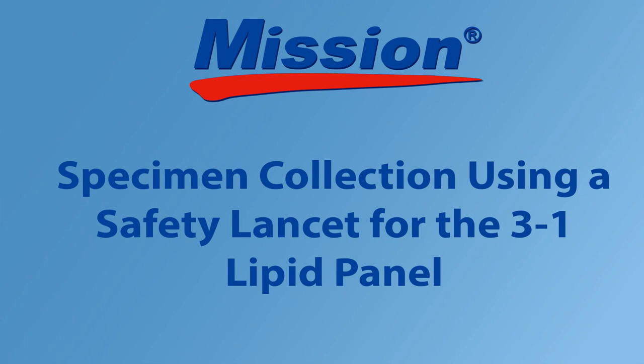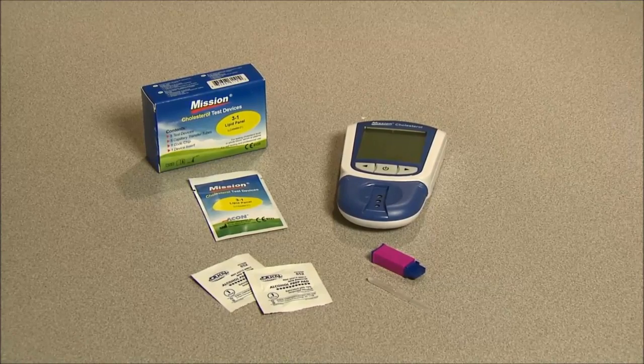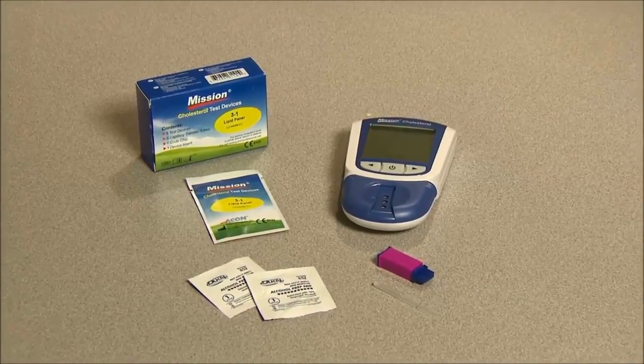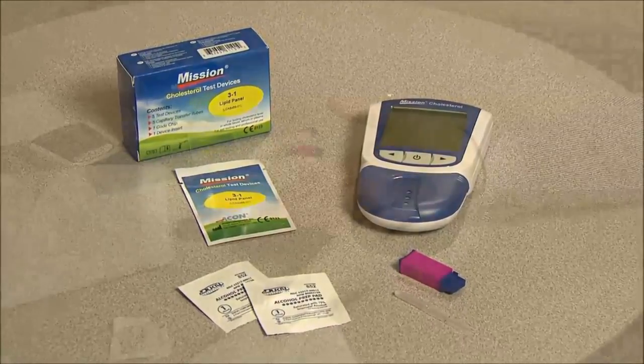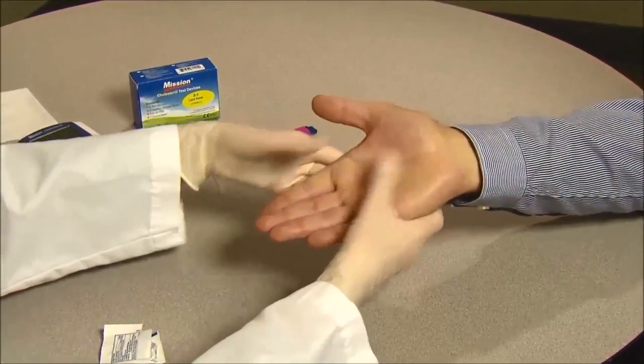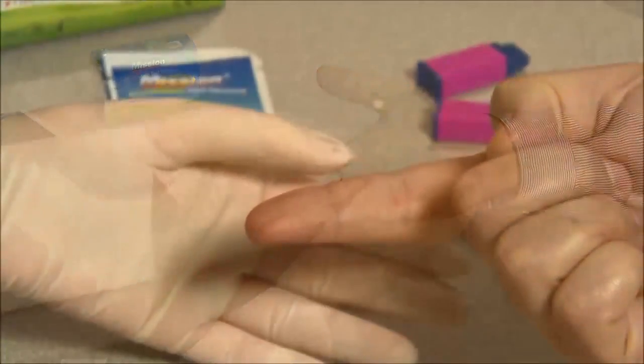Specimen collection using a safety lancet for the three-in-one lipid panel. For the three-in-one test it is recommended to use the safety lancet to collect 35 microliters of specimen. Massage the hand from the wrist up to the fingertip a few times to encourage blood flow.